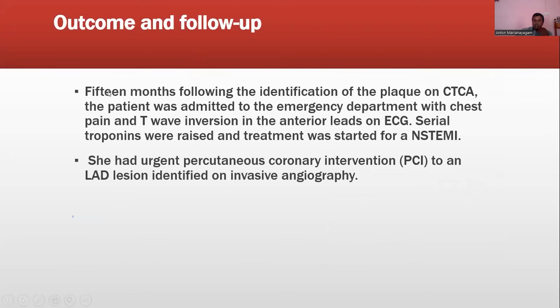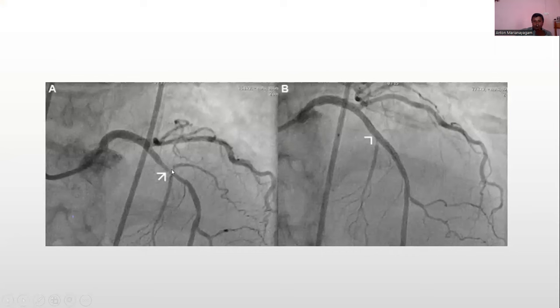After 15 months of identification of this particular plaque, the patient was put on medical therapy, but unfortunately the patient attended the emergency department with T inversions and positive troponin, and treatment was started for non-STEMI. Then she had an urgent PCI for an LAD lesion. So you see, this is the angiogram of the particular patient, and now this is after angioplasty.